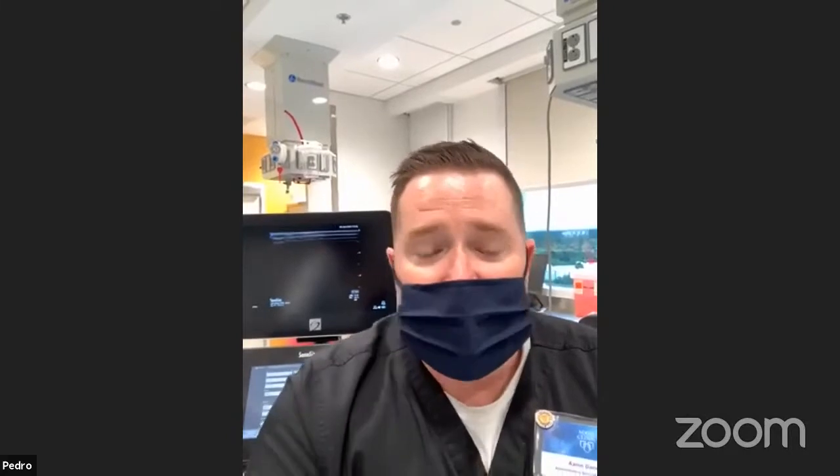The camera that I showed you goes down in your throat, and it sees your lungs. So they can go to all the different branches of your lungs and make sure that it's good and clean in there. And if it's not good and clean, that robot tower that I showed you that had all that equipment has suction on it. And they can actually suck all that fluid out of your lungs, or suck all that bacteria out of your lungs with the same scope.